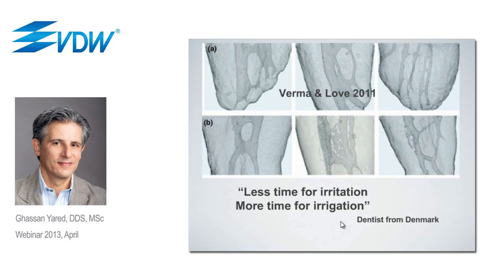These systems can be cleaned with the irrigation. The final irrigation is the most important step, and this is what will clean these root canal systems. And one dentist from Denmark said it very well. He said that with Reciproc, the treatment is faster, but we have more time for irrigation.